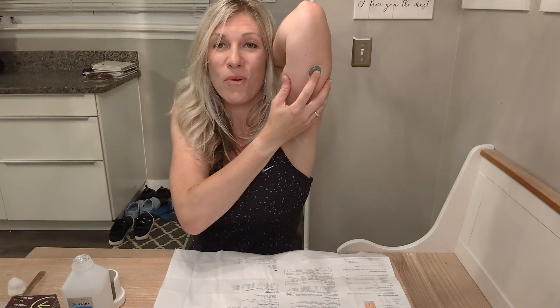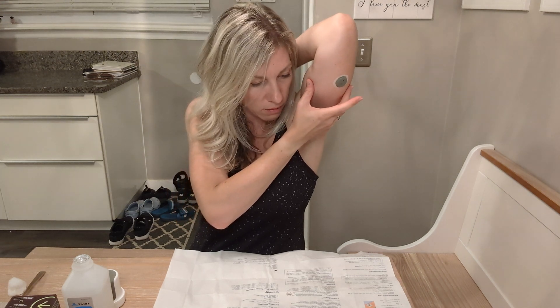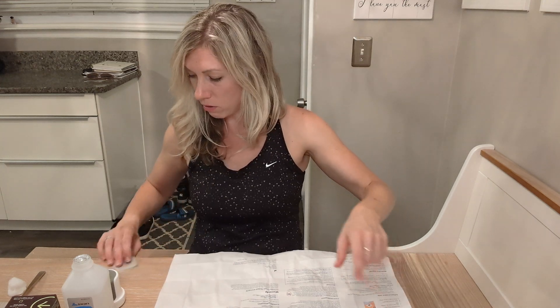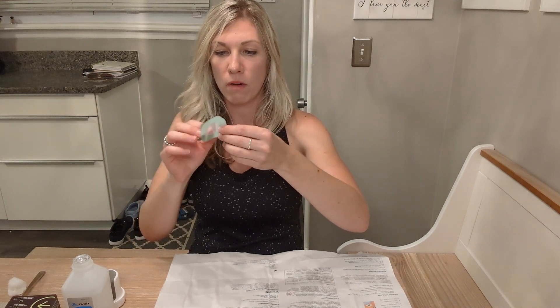Then it says you have to push and hold for 10 seconds. One, two, three, four, five, six, seven, eight, nine, ten — one extra second, just because. Now we have to apply the over-patch, which is this little thing here — that's just to make sure there's some extra adhesive so it doesn't get pulled off.